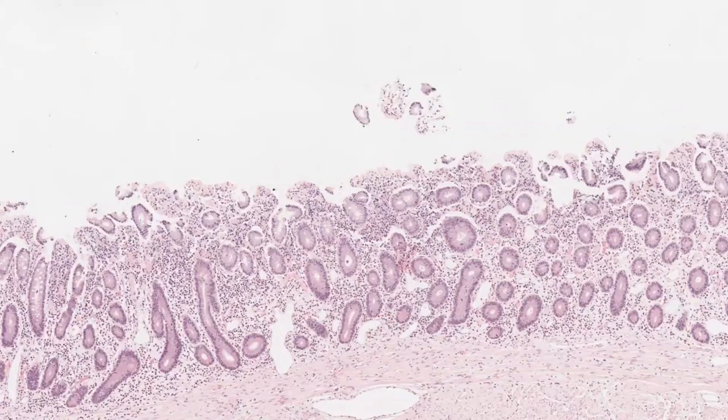And over the next 5 or 6 or 7 minutes, I will just show you a few examples of cases, just to think a little bit about it with me, okay? We have, okay, so if I ask you, is it a small bowel or large bowel? Okay, so this is a question that you have to ask yourself, and then you will say, okay, it depends, because if this is now from the pouch, then this is adaptive changes in a small bowel. Okay, so now you already know this answer for this.